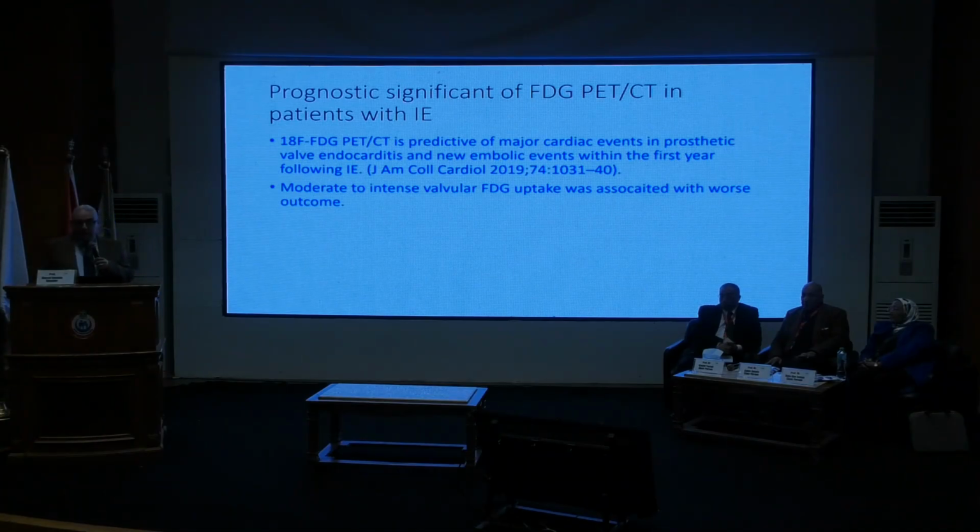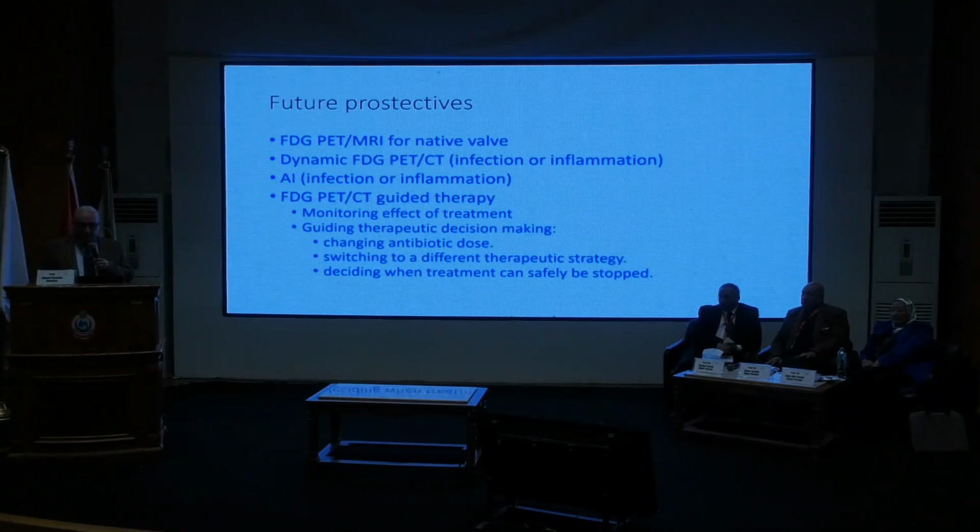Other studies have been performed and could not find any correlation between the FDG and prognosis. So it is not a definite correlation, not definite that the FDG will have a prognostic significance.